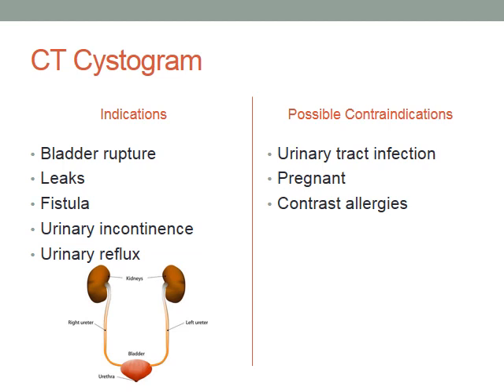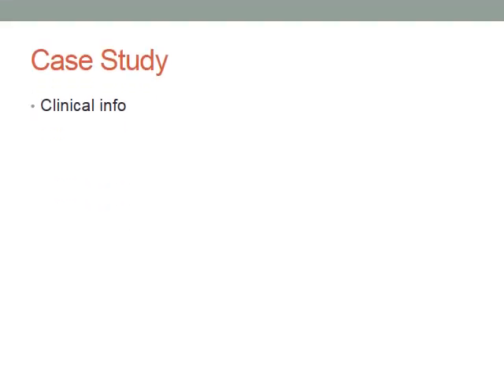Possible contraindications include pregnancy, contrast allergy, or UTIs. CT cystogram is best for evaluating bladder trauma, of course, but it can also be used in diagnosing neoplastic diseases.